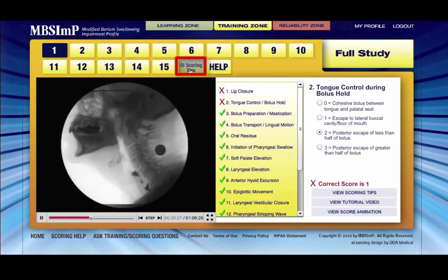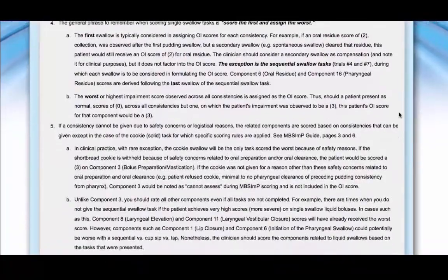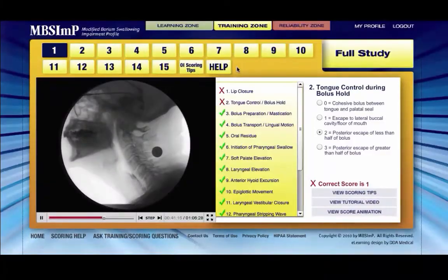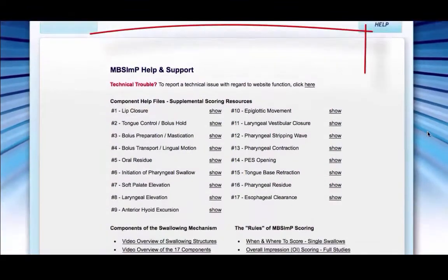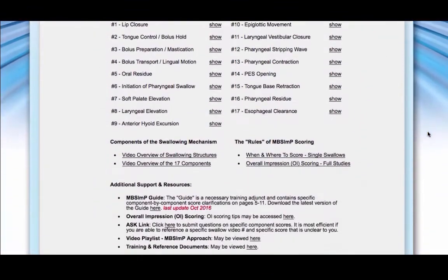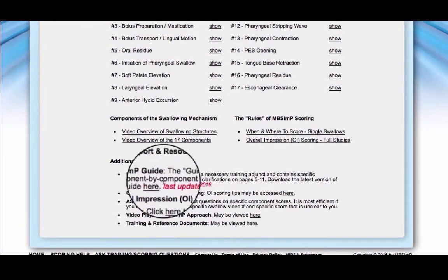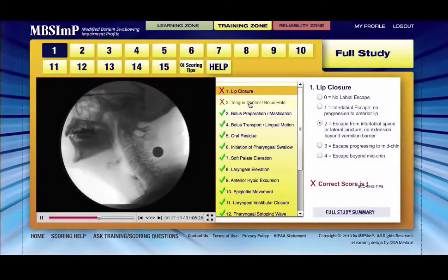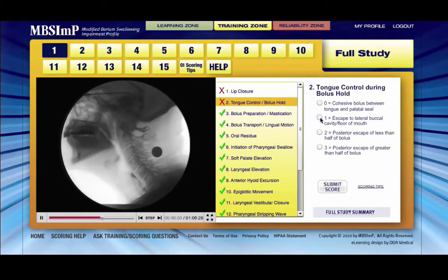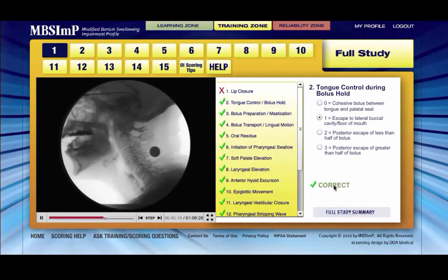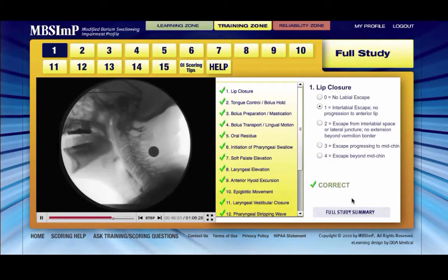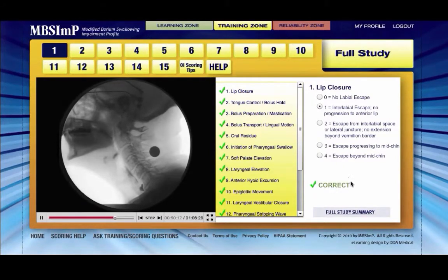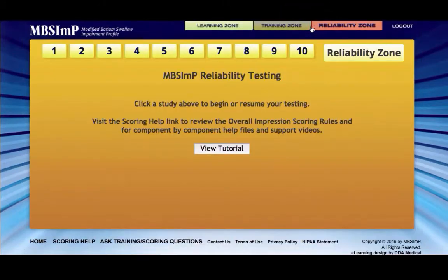Overall impression scoring rules can be viewed as needed by selecting the OI scoring tips link. Likewise, the help link reveals the component-specific help files and a link to the MBS-IMP guide for review as needed. The full protocol studies can be scored repeatedly, providing the opportunity for ample review, study, and practice before moving on to reliability testing. Each must be scored at least once before access to the reliability zone is granted.